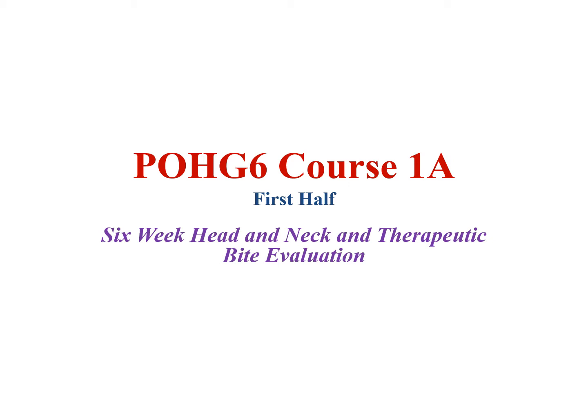So you're doing the patient self-evaluation of TMD treatment, one, and you look at there and you say, oh, gee, this is like 6 weeks or 7 weeks. We need to remove the ramps if the patients learn the therapeutic bite. We need to look to see if the neck has improved and do a physical therapy referral if needed, which is usually true.